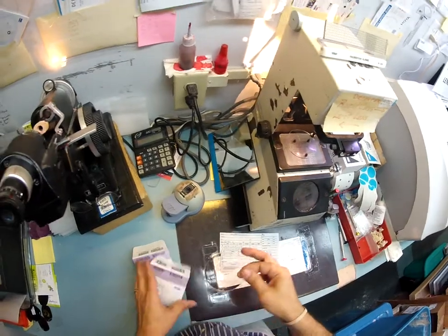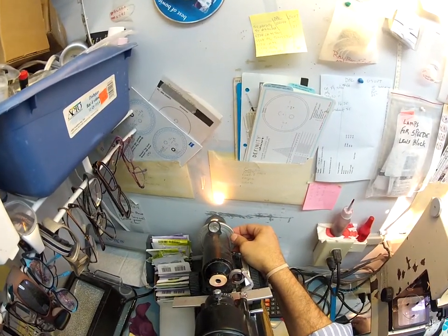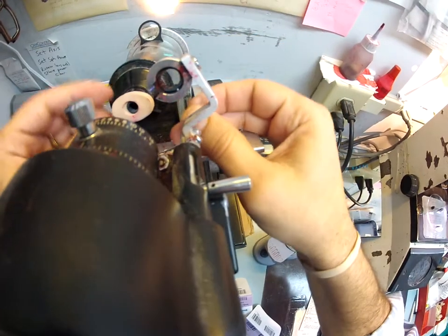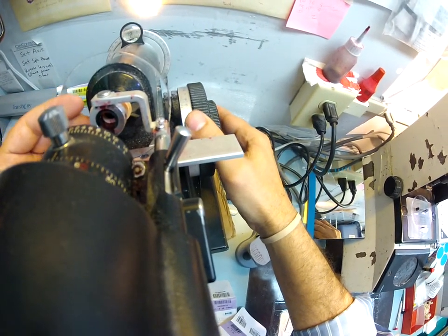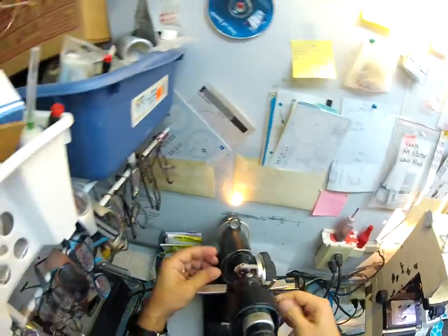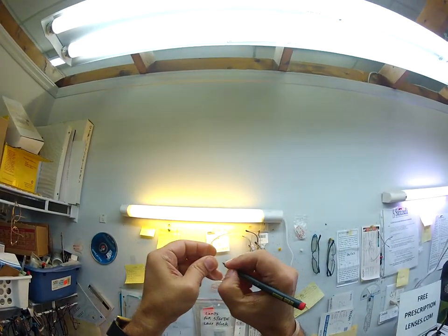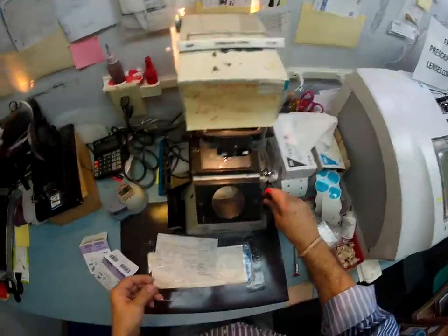Let's do the same thing for the left, which is 76. Let me spin the axis wheel to 76. And -1 it is. Rotate that till the sphere power comes in clearly. Optical center is dead center in the crosshairs of my scope. Put some dots on there. Use my pen to darken those dots. And put an L on there for left.